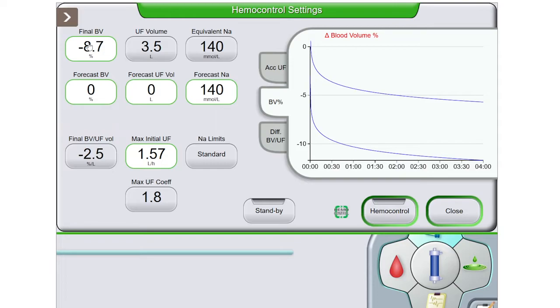So making it more negative is like your gas pedal. It's saying go, go, go. Making it more positive is like your brake, saying whoa, whoa, whoa. So it will adjust these parameters. You're going to see this a little easier when we actually look at the simulation.